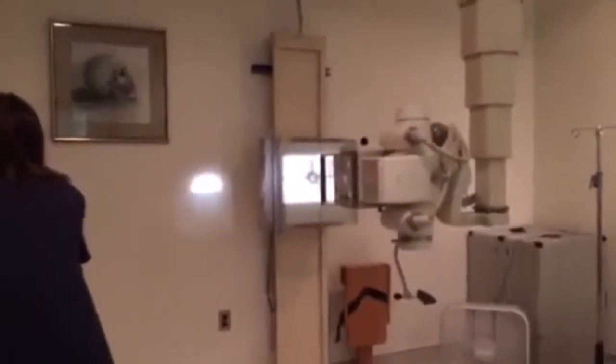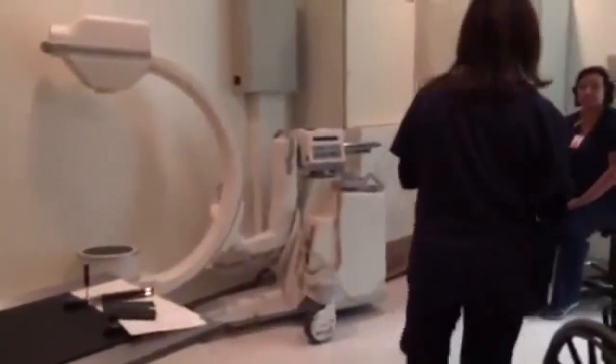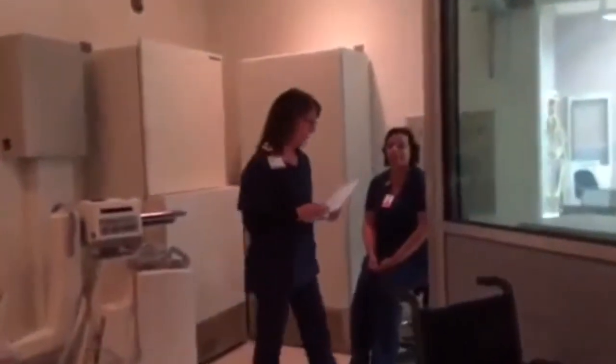Make sure that I have my shield, there it is, my shield is ready. Okay, I'm ready to get my patient. I'm going to get my requisition, and I'm going to verify the order with the doctor in the computer. I'm going to enter my patient name, last name, first name, date of birth, gender, and then I'll enter my exams. All right, I'm ready to get my patient.